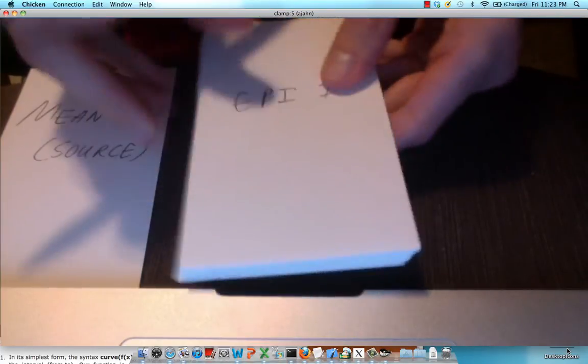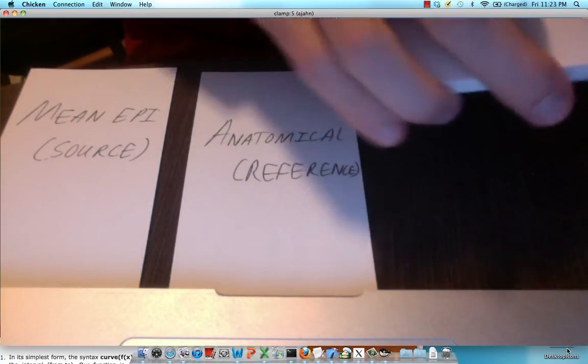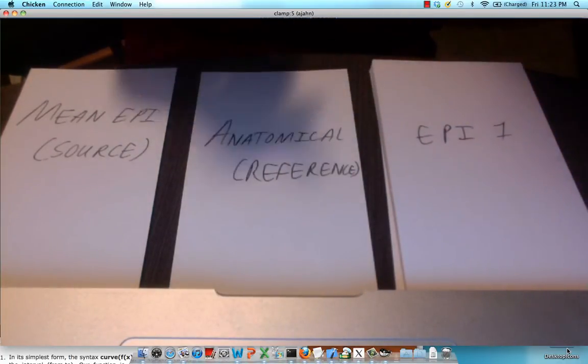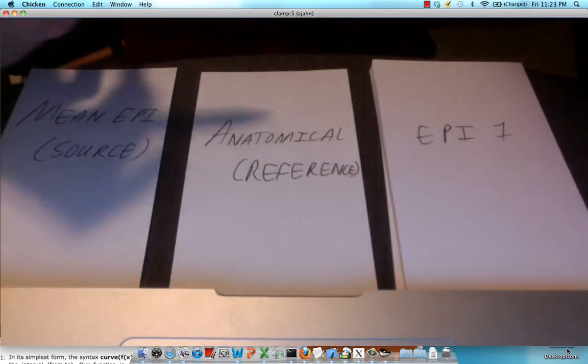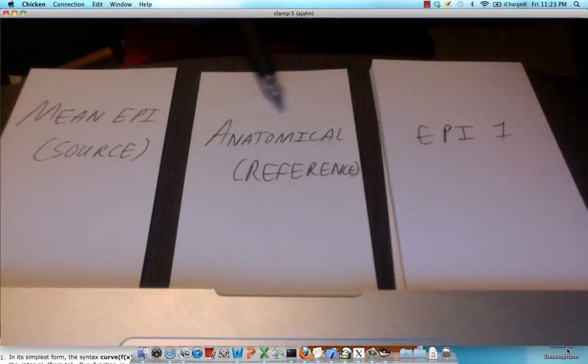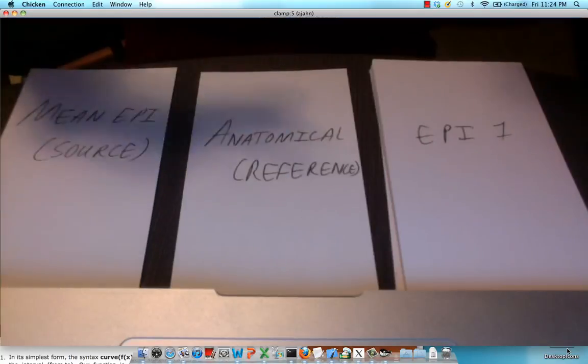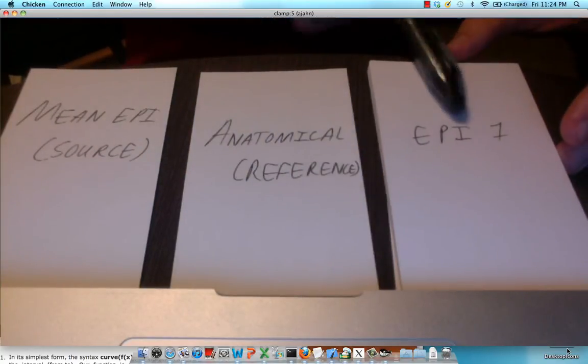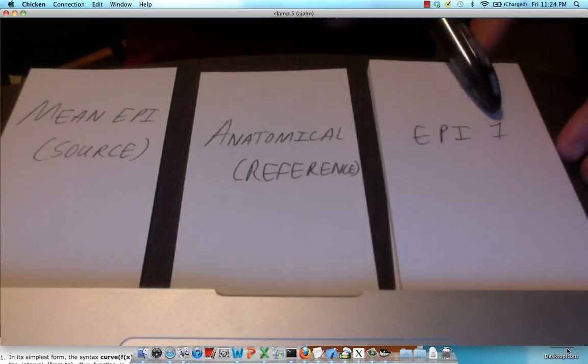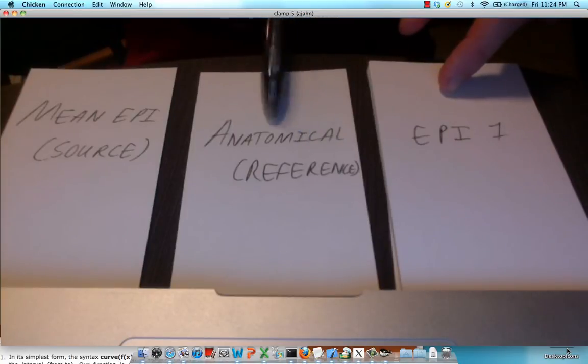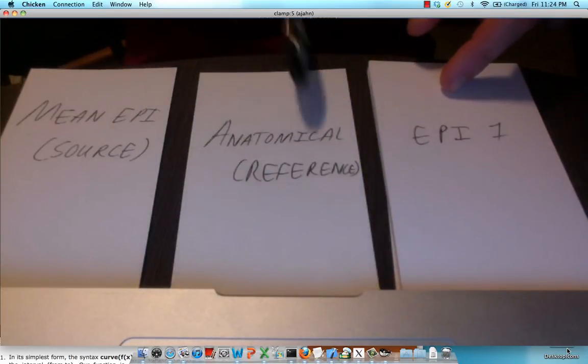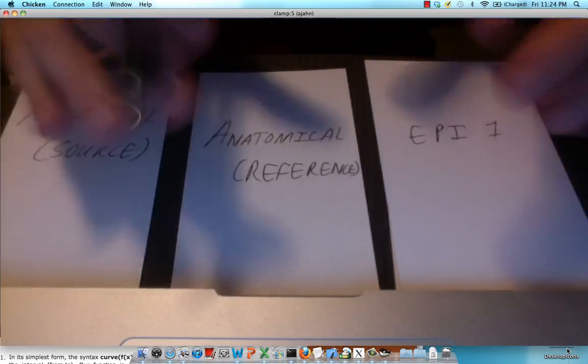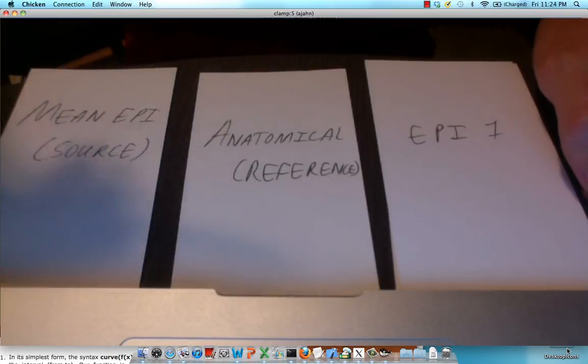This is important for two reasons. First of all, it co-registers or aligns two different modalities, the T2 and the T1 weighted images. This is important because when we warp our images to a standardized space, that's also a two-step process. We'll warp this anatomical image to a template in say MNI or Talairach or any other standardized space and we'll apply those same warps to these functional EPI images. That's important because these are directly in alignment with each other, the same warps applied to this anatomical image, which has a higher spatial resolution and usually has a better warping to this template space, will then be applied to these functional images. So that's a visual demonstration of how co-registration works and why it's important for normalization.